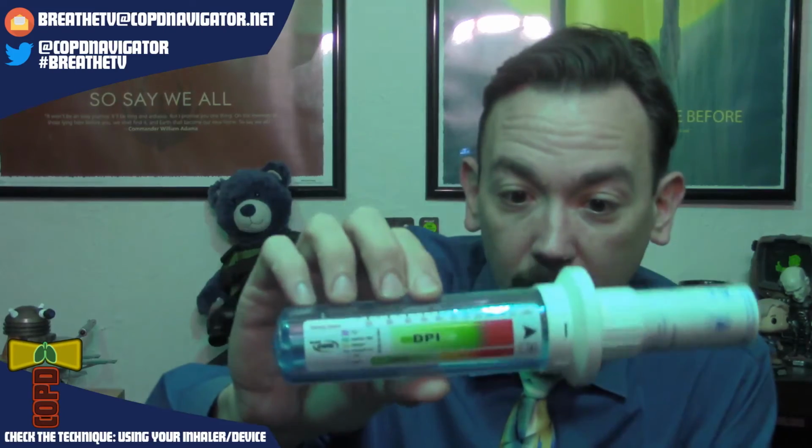If I rotate this all the way down to maximum resistance and do that same maneuver, it is a lot more challenging. And I'm not able to generate as much peak inspiratory flow. Now I'm down into that 60 range. Now, theoretically, the device at this maximum resistance, the Handihaler, supposedly actually takes some of that into account, and you should only need about 30 liters per minute.